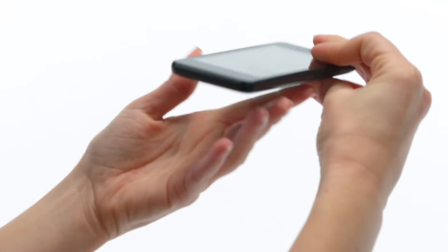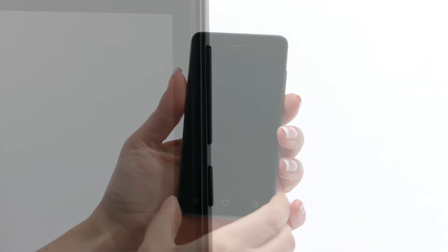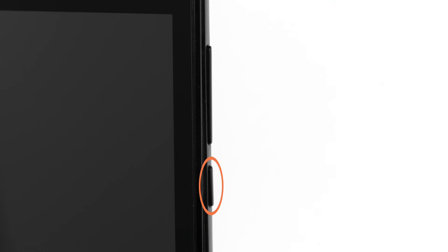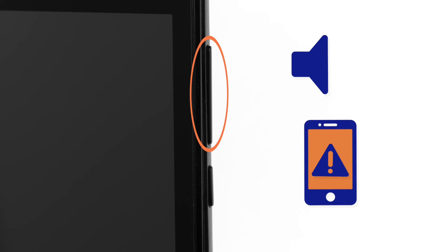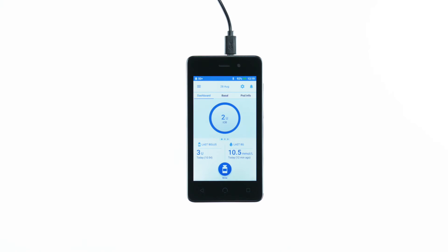To turn on the PDM, press and hold the lower, smaller of the two buttons on the side of the PDM. The larger of the two buttons controls the volume. You may increase the volume or decrease it down to vibrate. On the top of the PDM, you will find the micro USB port for charging or data exchange.